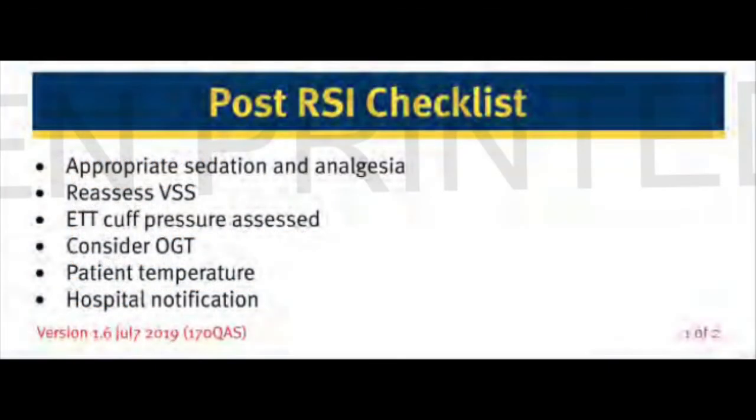Really also important, make sure you check your ETT cuff pressures through a manometer. You don't want to overinflate that cuff.